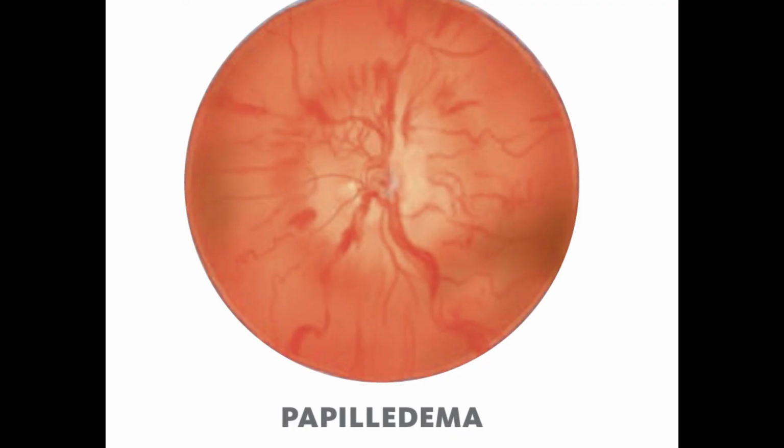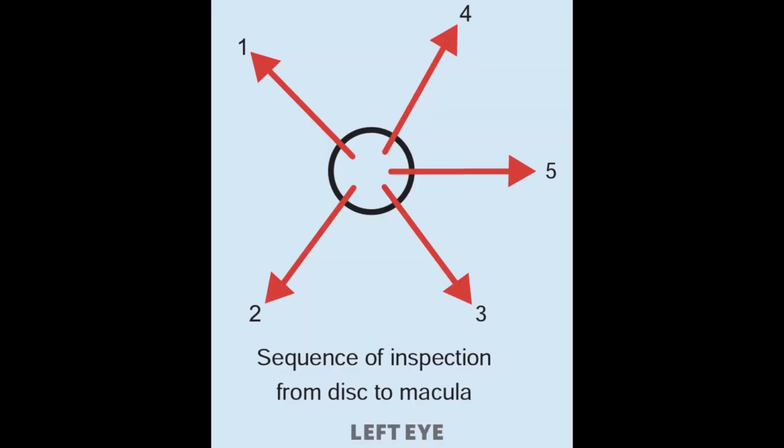Now bring the optic disc into sharp focus by adjusting the lens of your ophthalmoscope. If both you and the patient have no refractive errors, the retina should be in focus at 0 diopters. If structures are blurred, rotate the lens disc until you find the sharpest focus. For example, if the patient is myopic or nearsighted, rotate the lens disc counterclockwise to the minus diopters. In a hyperopic or farsighted patient, move the disc clockwise to the plus diopters. You can correct your own refractive error in the same way.